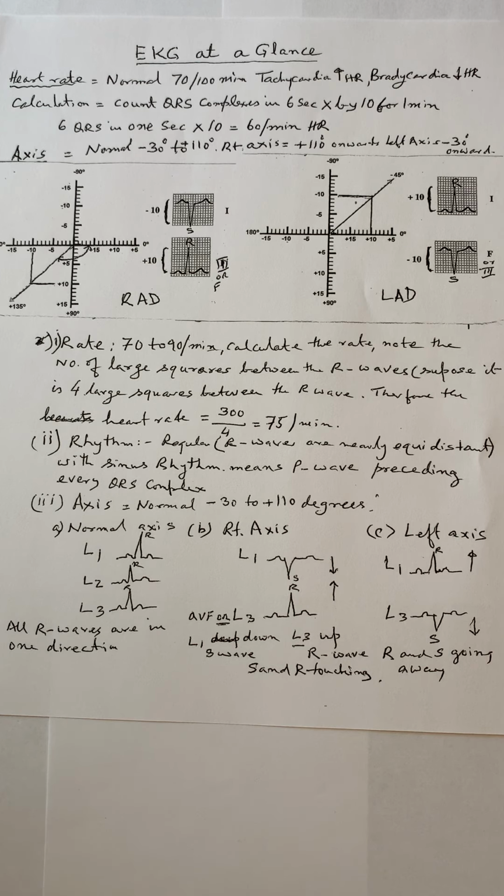I hope the diagram and details could help you to understand rate, rhythm and axis. This is for today. Another day we will continue how to read ECG. This is how to read ECG.